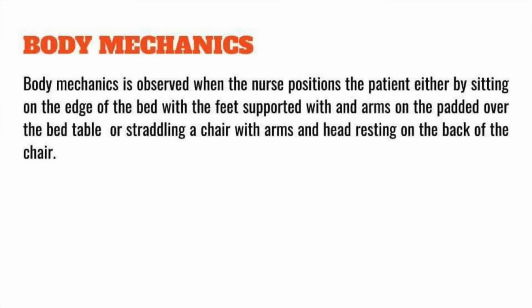Third would be body mechanics. Body mechanics is observed when the nurse positions the patient either by sitting on the edge of the bed, with the feet supported, with arms padded over the bed table, or straddling a chair with arms and head resting on the back of the chair.